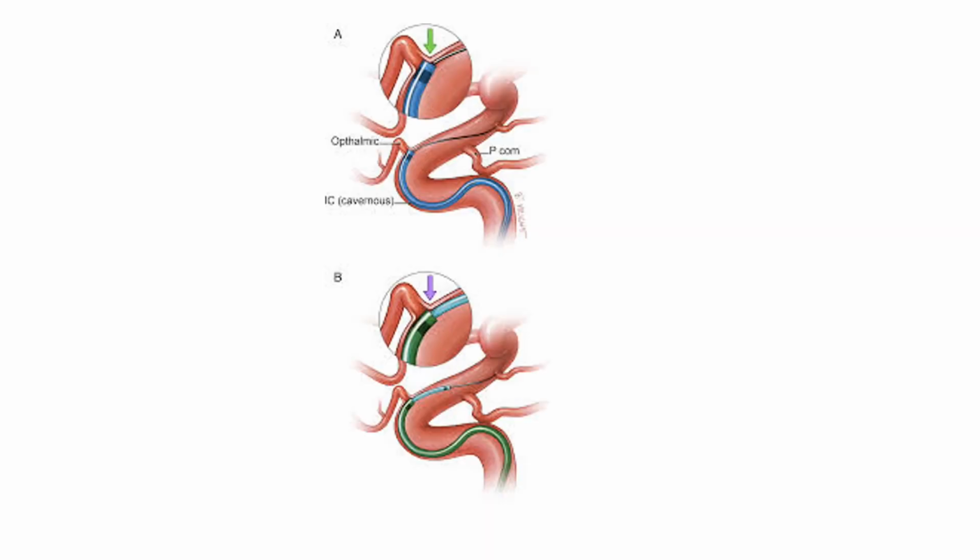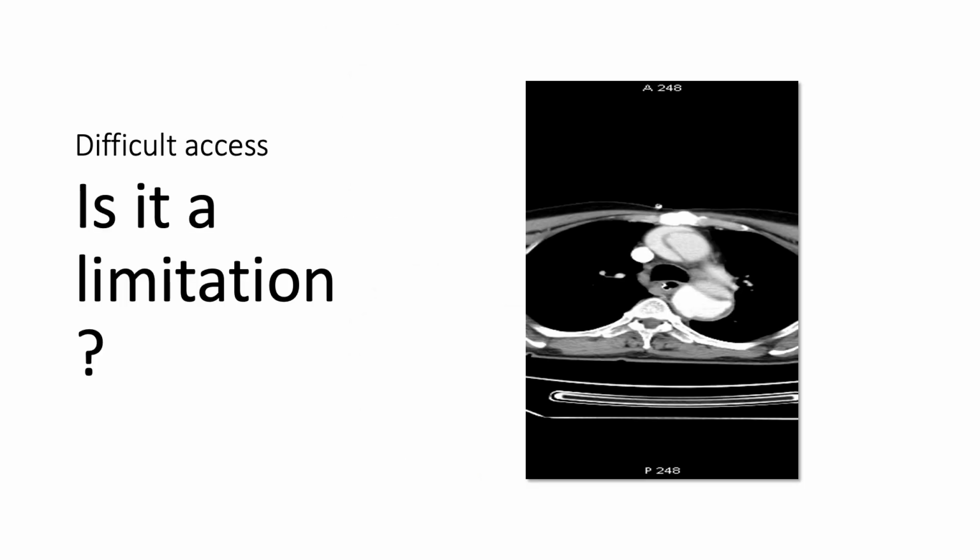Now, when you take these devices, sometimes they will get stuck at the ophthalmic artery. So I know that Stryker is coming with a beautiful device, which is like a dilator that goes in and prevents this step. Otherwise, remember, the 2.7 catheter is necessary for this because that will take the step out and you will be able to cross. Otherwise, you will not be able to cross.